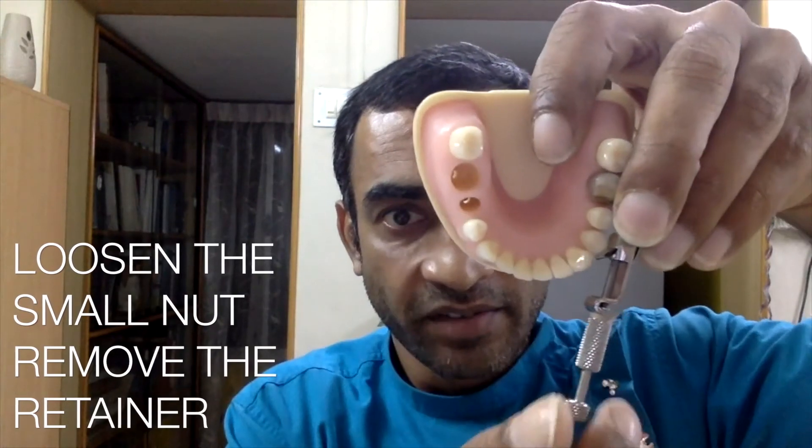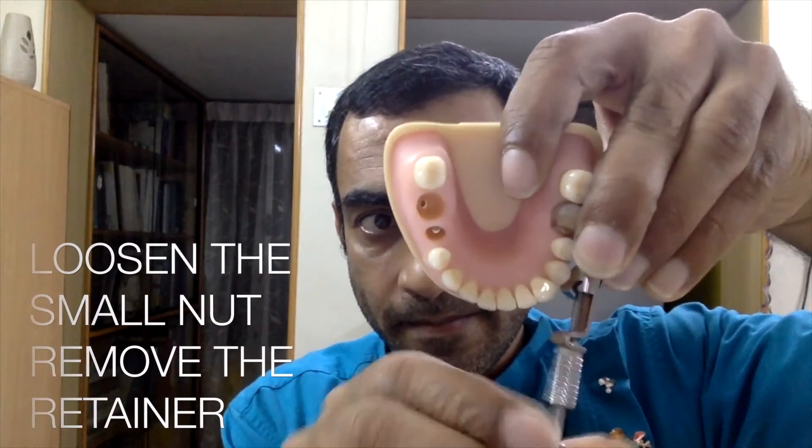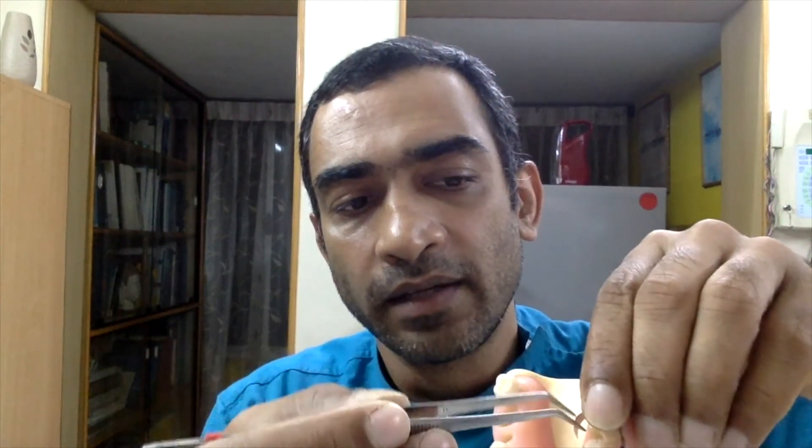As you loosen the small nut, you'll find the retainer comes off. Then carefully take the band and remove it from the tooth. This has to be done after you've achieved a good set for the restorative material — if it's composite you don't need to worry, but if it's amalgam, please wait at least 10 minutes before removing, otherwise your work will come off with the band. Thanks for listening, and I hope it helped. Stay tuned for more videos from the Dental Adviser — ciao!